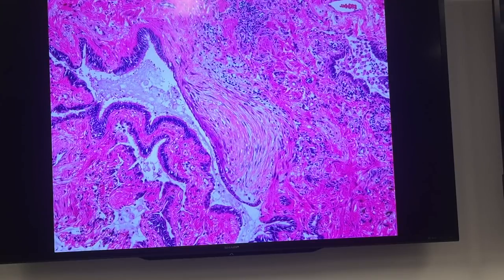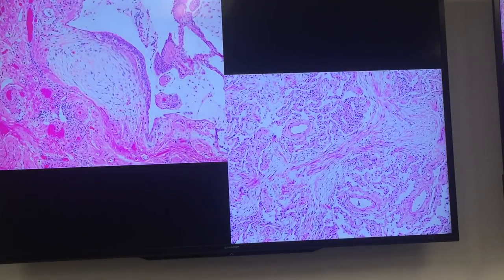What is this, guys? Fibroblast focus, yeah. Dome shape, no inflammation within the interstitium. What am I showing you here? The contrast between what and what? Focus and plug. Yes, focus and plug. Left upper is focus, right lower is plug. Left upper is UIP, right lower is organizing pneumonia. Totally wrong to say that you can't tell these apart.